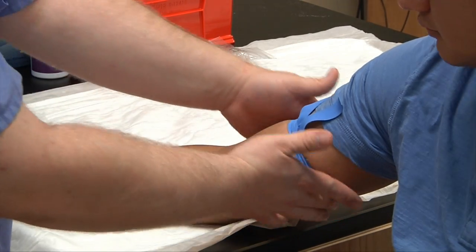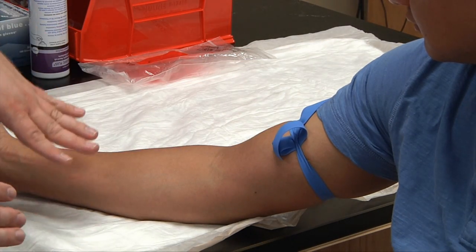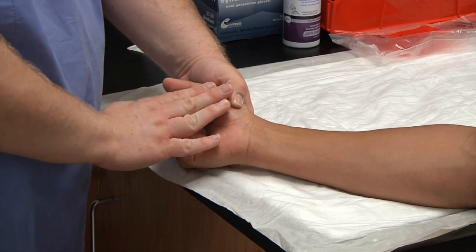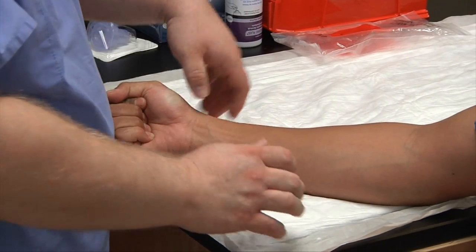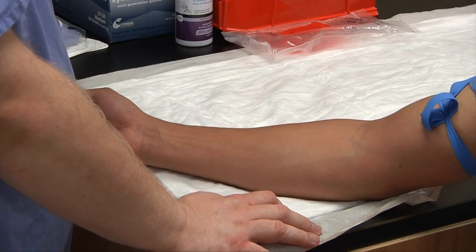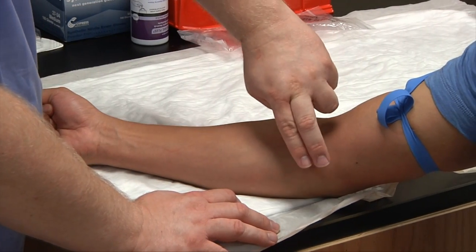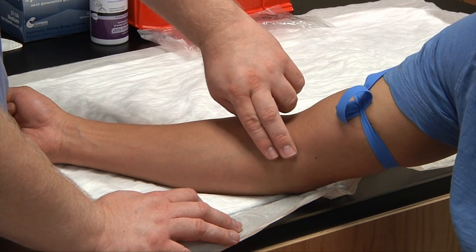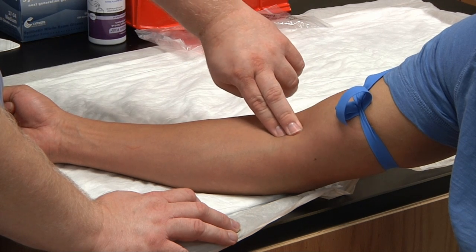We have our tourniquet in place — it's nice, smooth, and flush. We just need a little constriction to get the veins to pop up. Ask your patient to make a fist — not pump their fist, just make a fist — and this will help in finding the veins. With the two index fingers of your non-dominant hand, start from one side of the patient's arm and palpate, pushing in and down, moving gently across.